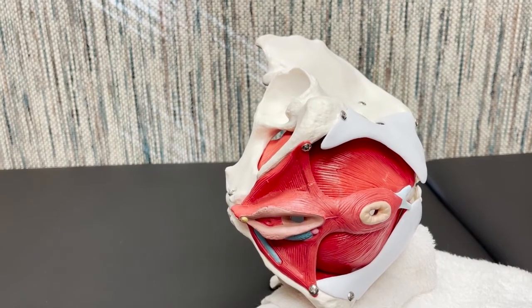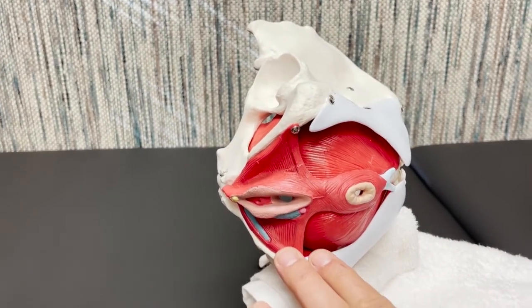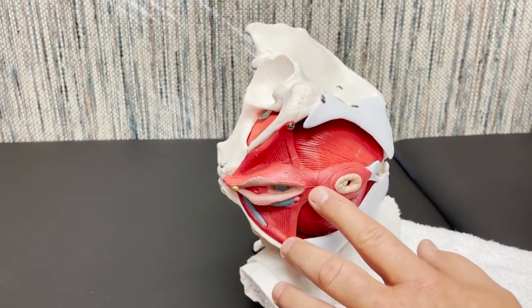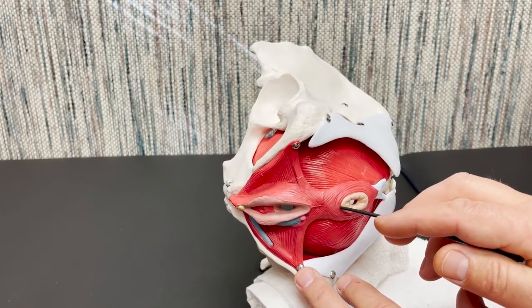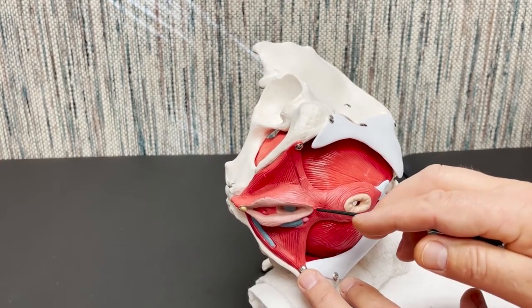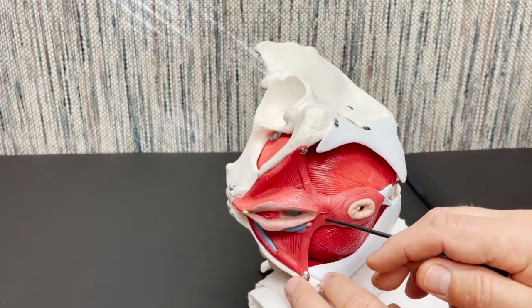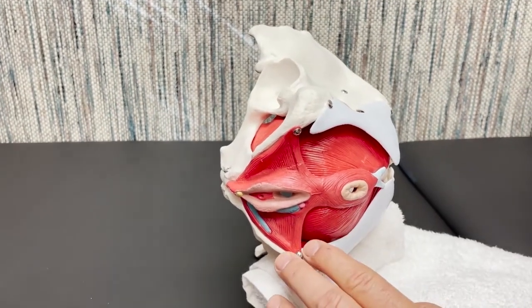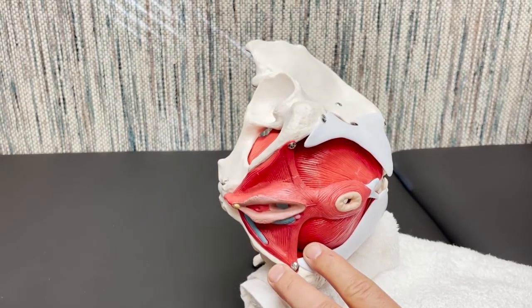We're going to palpate the medial side of the ischial tuberosity. Here we're going to be adjacent to the perineal body, which sits between the rectal orifice and the vaginal orifice. So sitting right here. We're going to confirm our muscle depth here with pelvic floor muscle contraction.